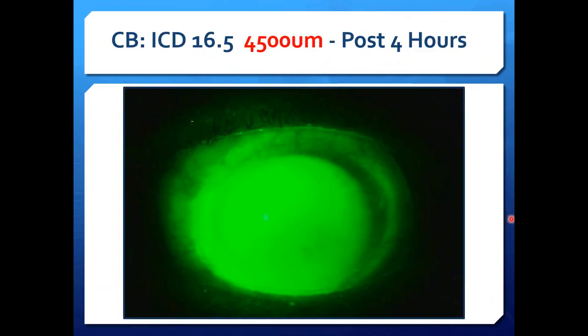Now here's the same patient after 4 hours of lens settling. So we sent the patient out the door for 4 hours and we want to observe how that lens settles. These lenses take hours to completely sink into the conj, so the longer you can have them in the lens, the better before you do your initial diagnostic. Now, is that possible for every patient, 4 hours of settling? Of course not, but go as long as you can. The longer you go, the more clear the picture becomes.